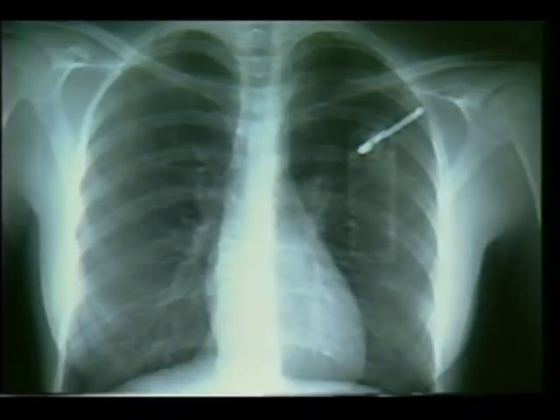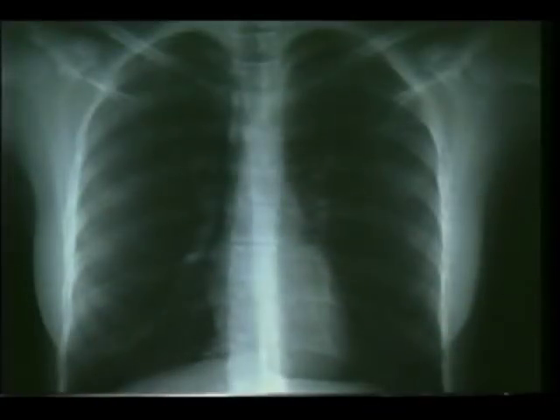This radiograph shows the position of the functioning thoracic vent catheter in the pleural cavity. This lateral radiograph demonstrates the compliance, conformability, and kink resistance of the thoracic vent catheter. This radiograph shows the patient's lungs still fully expanded after removal of the thoracic vent.